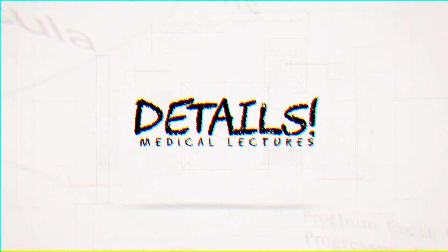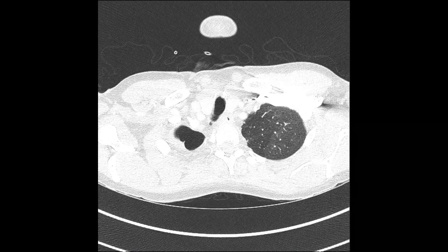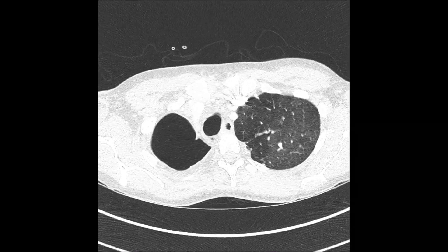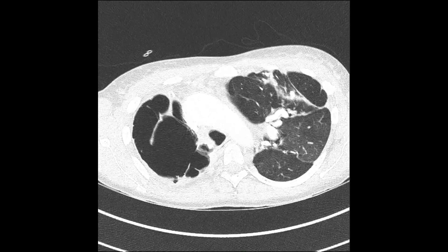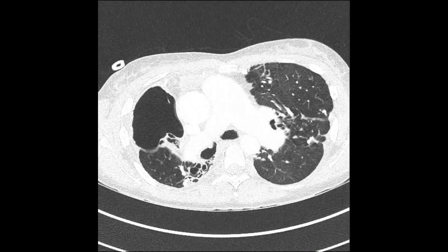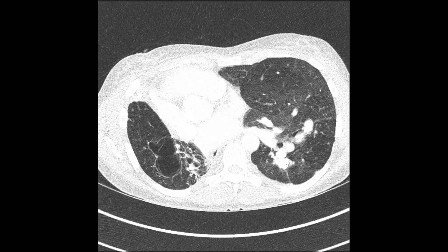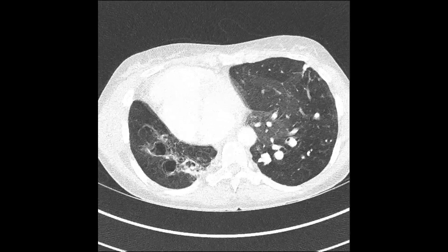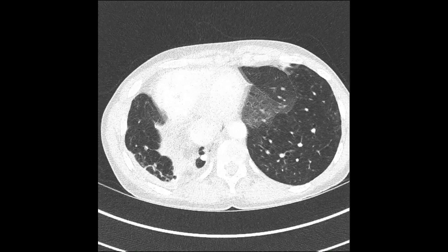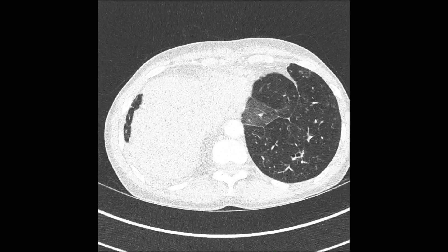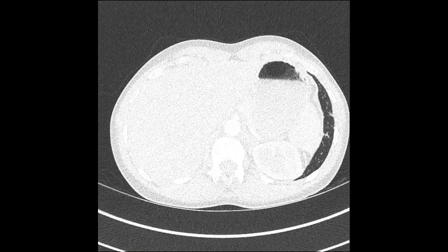This is a CT scan of a patient with advanced bronchiectasis, with a particularly notable finding of a huge bulla on the CT, which you can see on the left side of your screen. The other parts of the scan include saccular bronchiectasis of the right middle lobe and superior segment of the right lower lobe, with collapse of these lung segments.